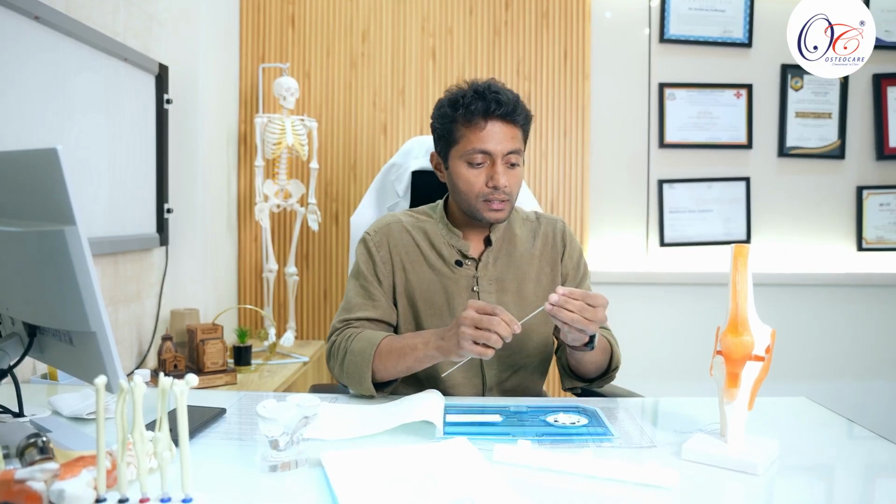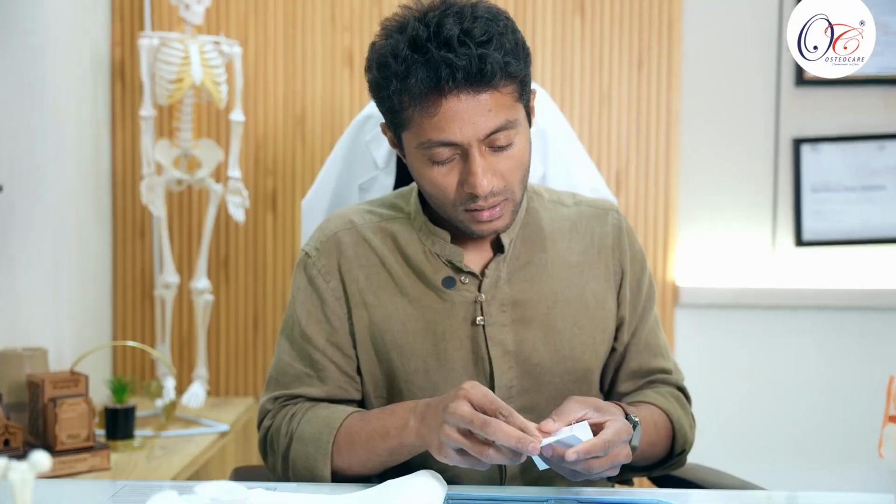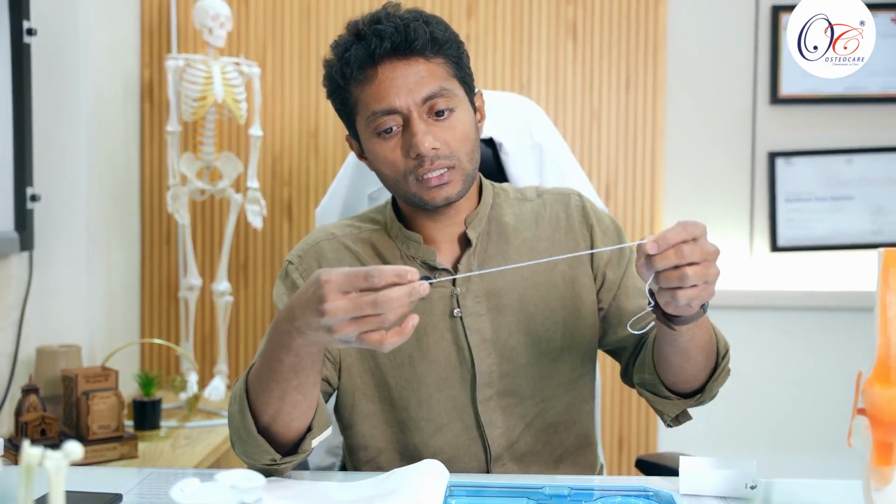This is the cannulated sleeve. I'll explain how we use it as well. And this is called the wire loop, and this is called the loop fiber. The loop fiber is actually fiber wire with a loop at one end, which you can clearly see, and a normal end on the other side.